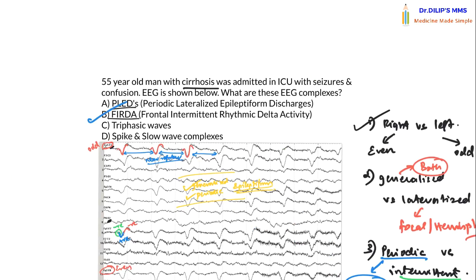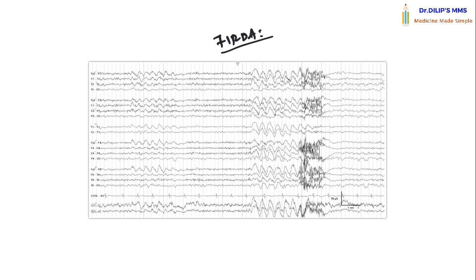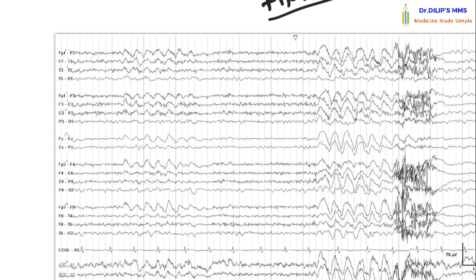The last pattern to discuss is FIRDA — frontal intermittent rhythmic delta activity. Let me show you what a FIRDA looks like. This is a clear example of a FIRDA EEG. First, this is seen in both hemispheres — you can zoom into the EEG and clearly see activity in the odd-numbered leads, indicating it is present on the left side.